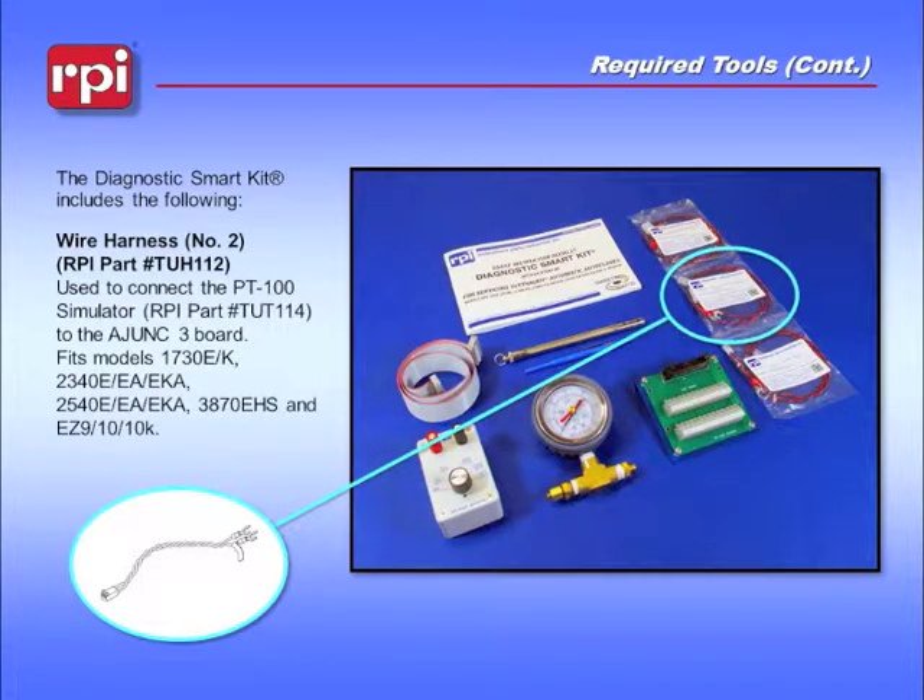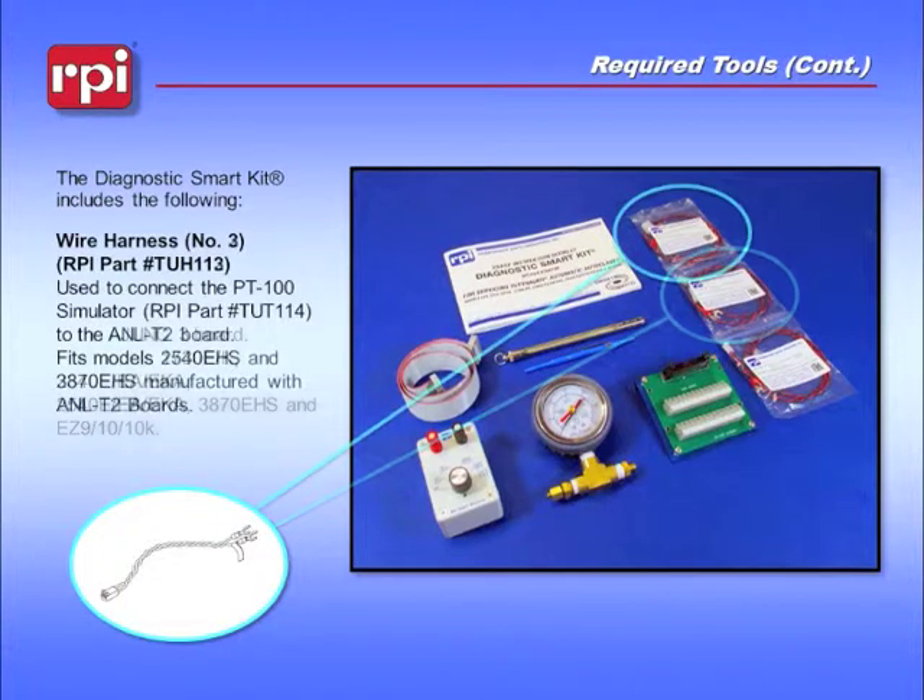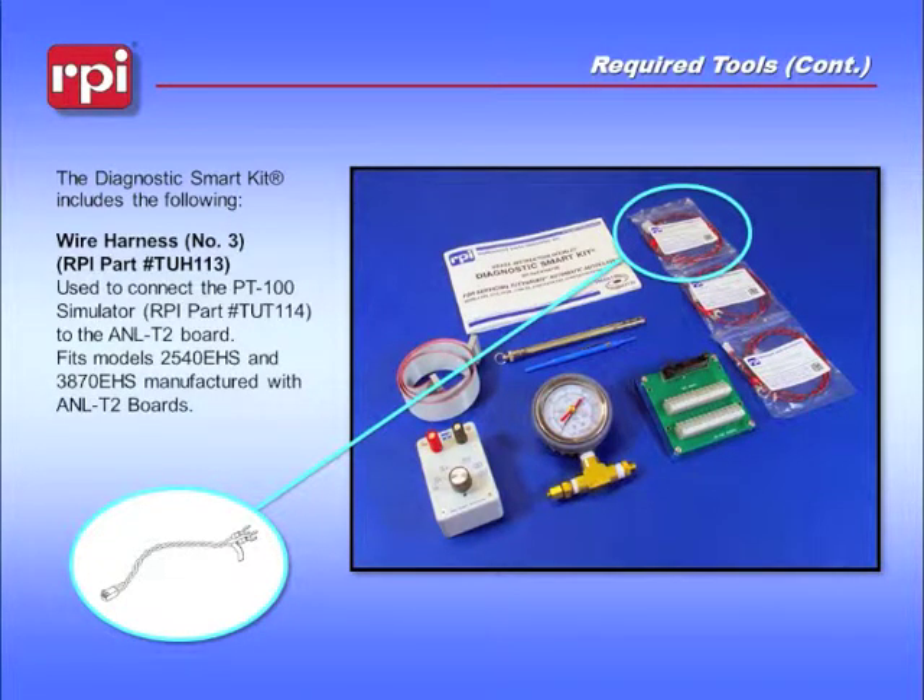The second wire harness is also used to connect the PT100 simulator to the Adjunct-3 board, but it is used on newer style machines. The third wire harness, the TUH113, is used to connect the PT100 simulator to ANL-T2 boards or Adjunct-2 boards.